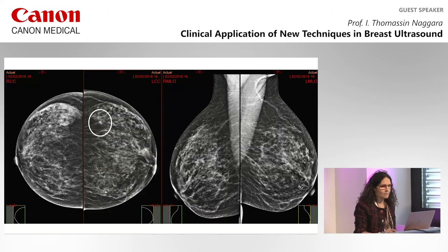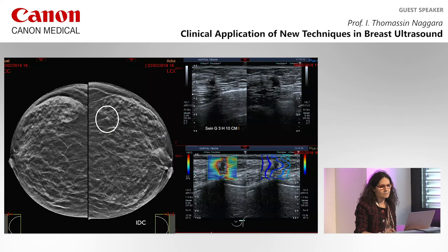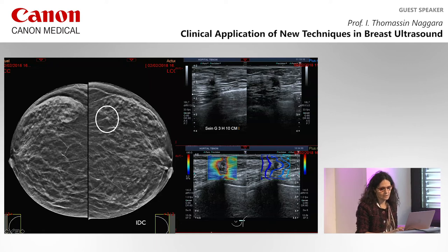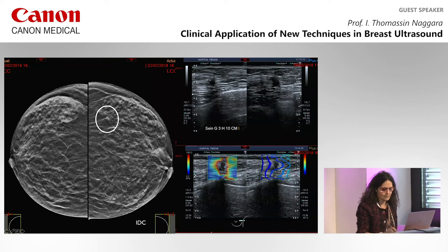Here is an example of a lesion detected in the external quadrant of the left breast — a spiculated lesion corresponding to a suspicious morphology on B-mode. You can see the result of the descriptive shear wave analysis with a typical deformation of the wave, typical air stiffness which is high around the lesion, and sometimes nothing inside, but the high stiffness surrounding the lesion is typically suspicious.